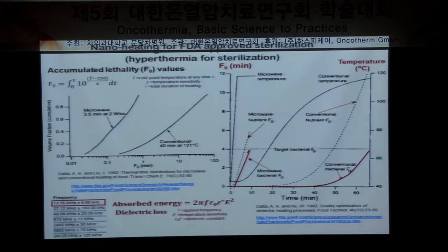The absorbed energy is calculated, which is the same as with us, and the frequency they are using is also on the FDA side: 13.56 megahertz is involved.